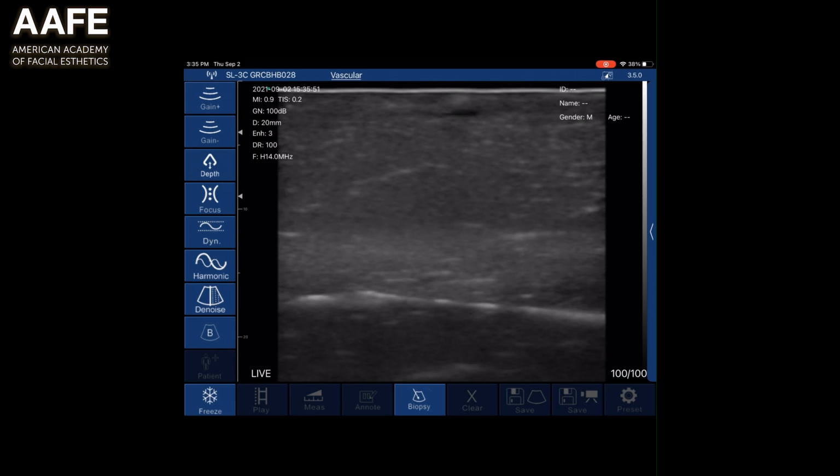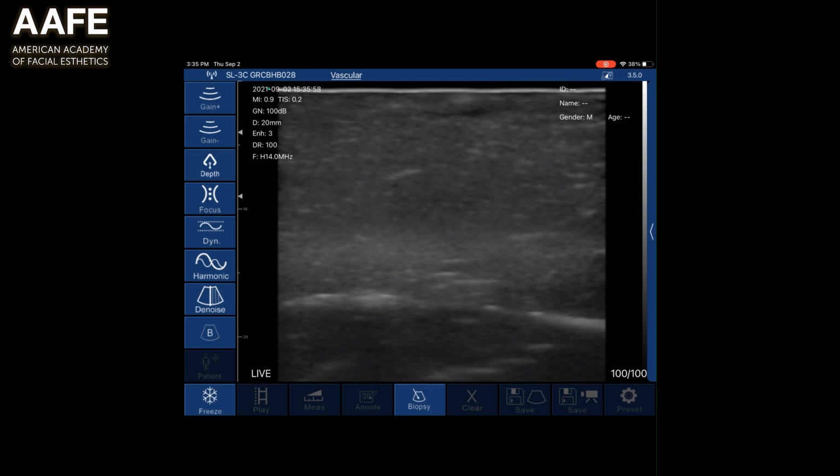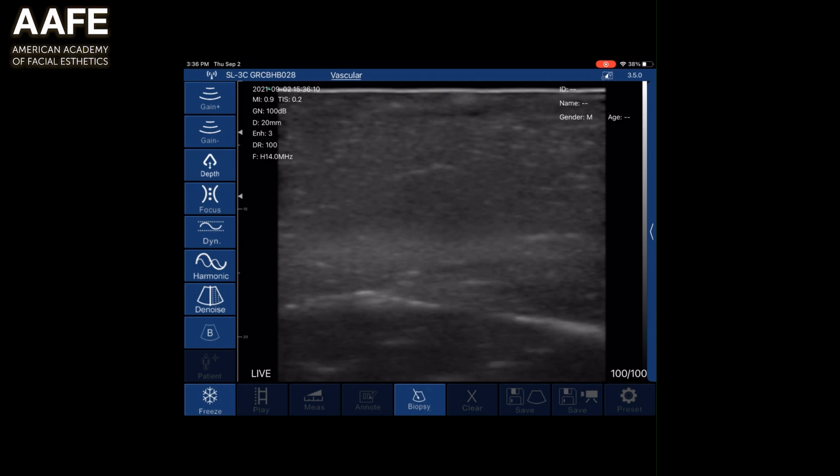How would I treat this if this was a real vascular occlusion or compression? I saw something happen clinically. I would go ahead and apply some hyaluronidase, not flood it, some hyaluronidase, start to massage it, get my ultrasound, put it in there, see what else, identify the filler, and then go ahead and use ultrasound guided injection so you can put the right amount of hyaluronidase without having to just shotgun it all over the tissue, cause a big mess, and can cause other problems. That's how you use an ultrasound guided injection.